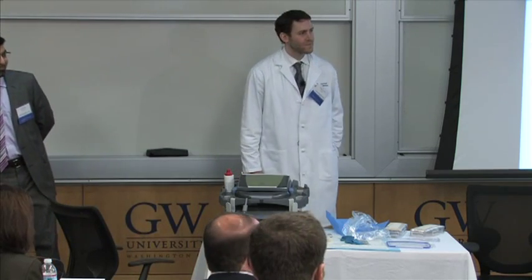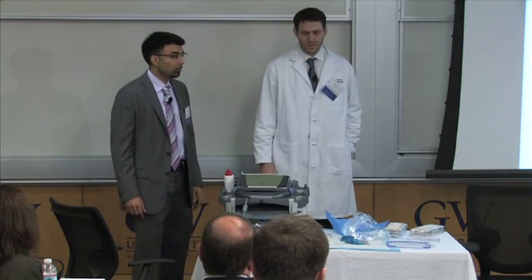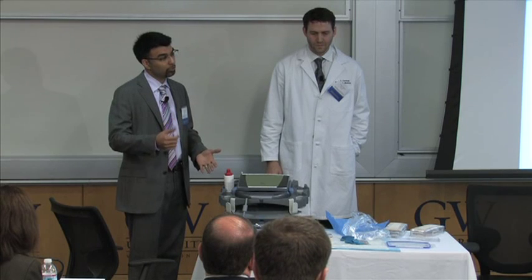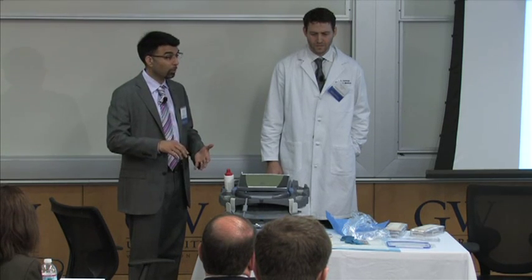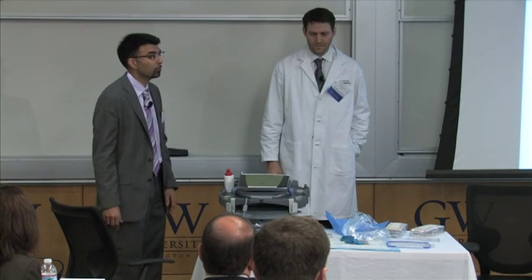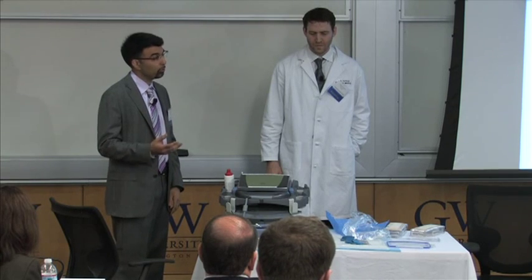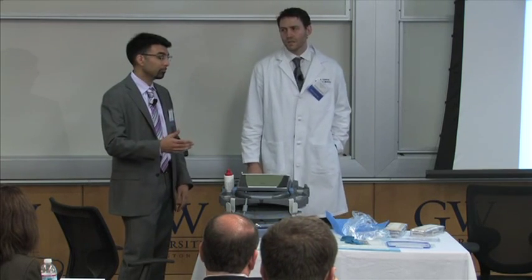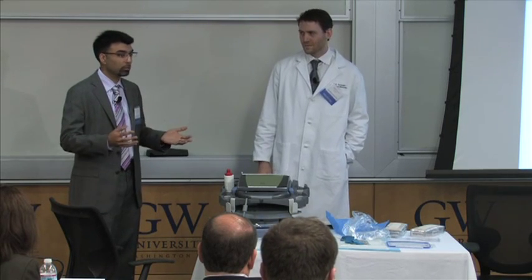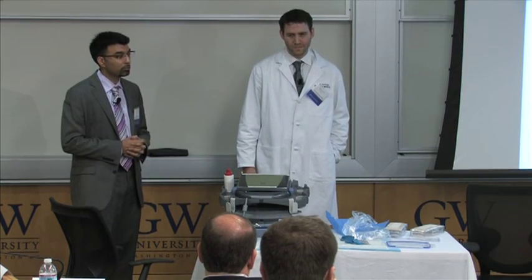On the regulatory side, do you see any concerns in terms of getting approvals, timing of that? I don't think so. I mean, the catheters have been around forever. We're really making changes to the mechanism to introduce the guide wire, which should not be a hiccup in regulatory because the parts going into the body are the same. With the coating, we will use materials that are biocompatible, and those have been used in clinical studies before. So we don't see any major hiccups through that process.